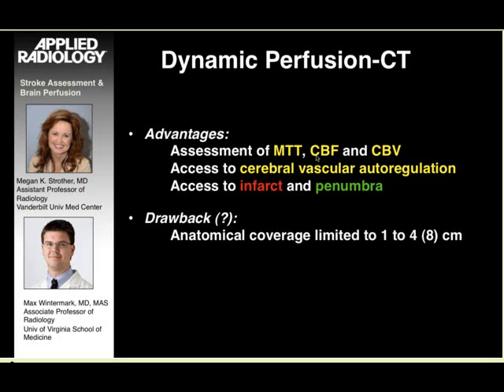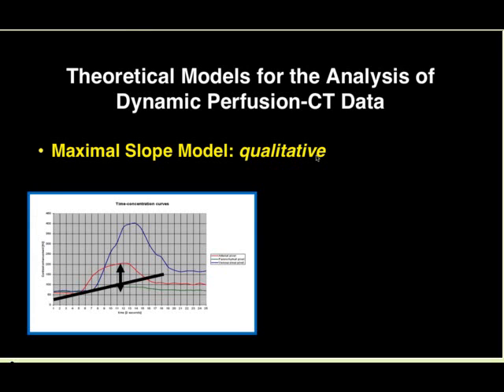Know if the type of CT perfusion that you are performing is just basically subtracting a non-contrast CT from a CTA, or if you obtain this dynamic sequential acquisition of sequential CT images during the wash-in and the wash-out of the contrast material. So that was the first thing that you need to determine about your CT perfusion technique. The second thing that you need to determine is what type of mathematical algorithm your software is using. And again, to be a little on the simplistic side, there are 2 big groups.